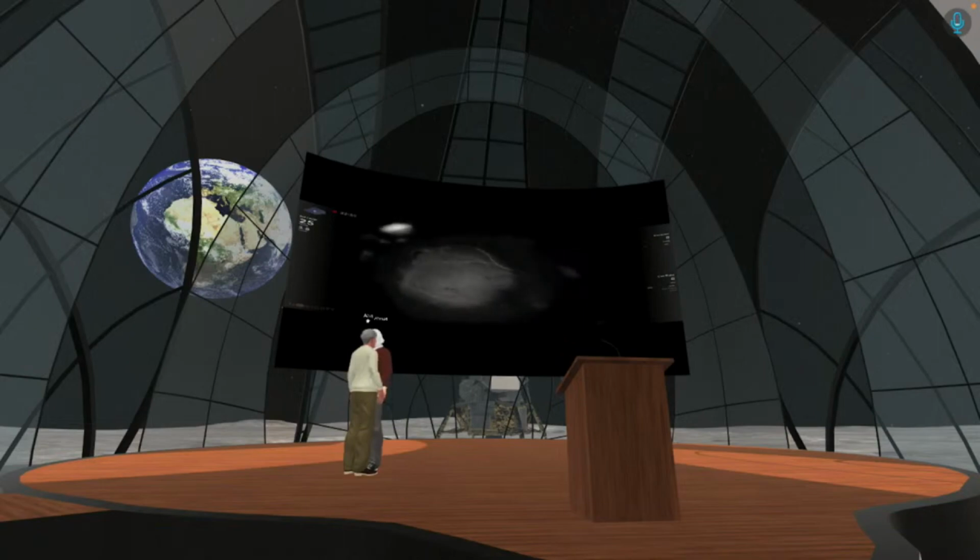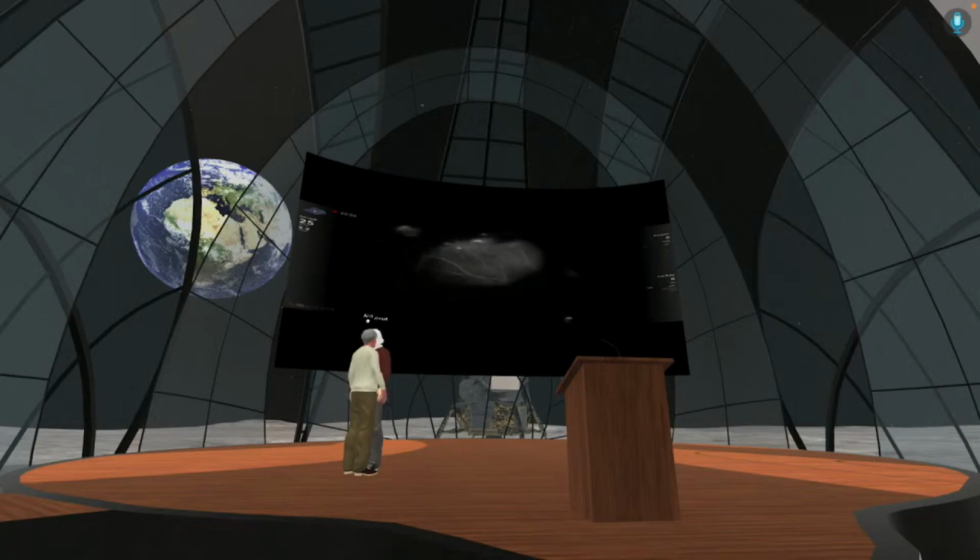Anyways, probably we are used more to the black and white image, and I find it with more contrast and detail separation here.